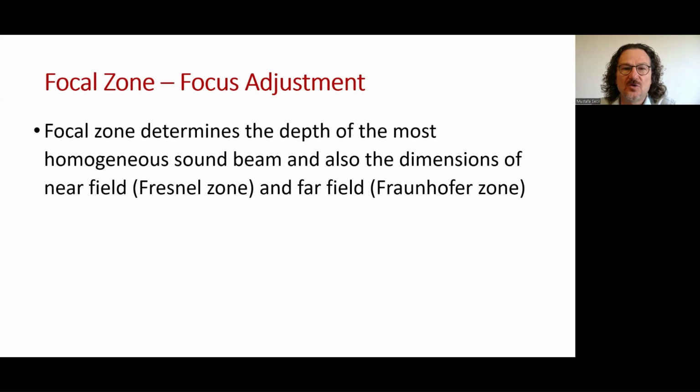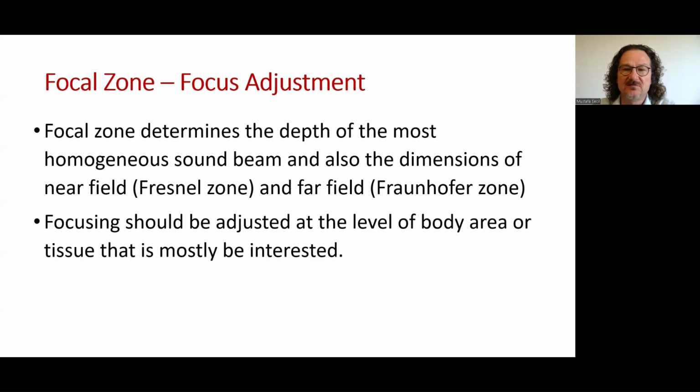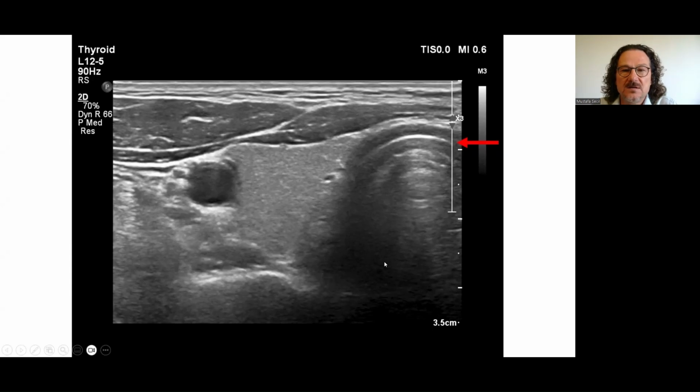The focal zone determines the depth of the most homogeneous sound beam and also the dimensions of the near field and the far field. Focusing should be adjusted at the level of body area or tissue that's most to be interested. This is an example of focal zone use.